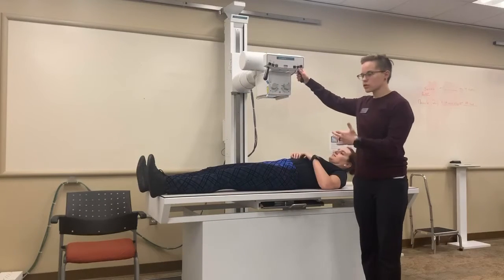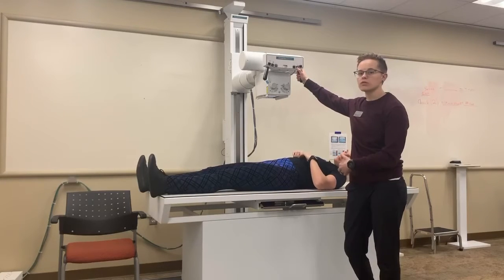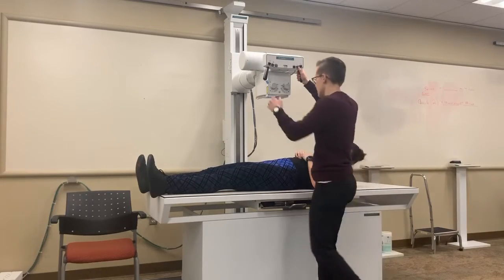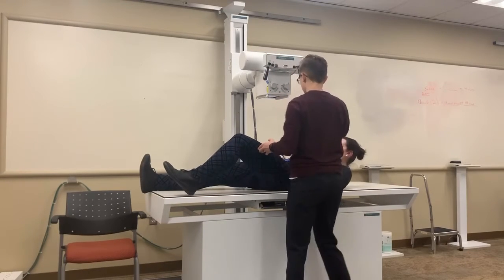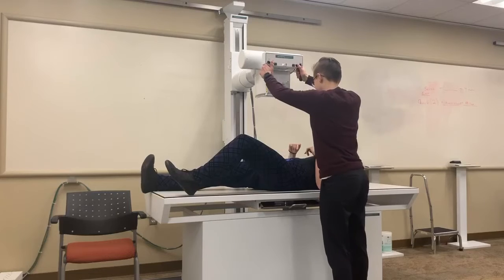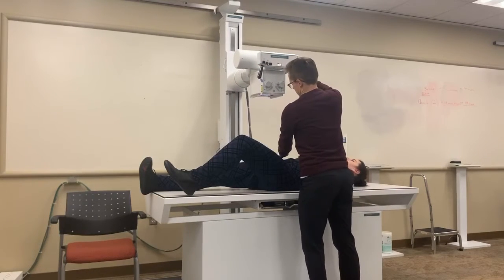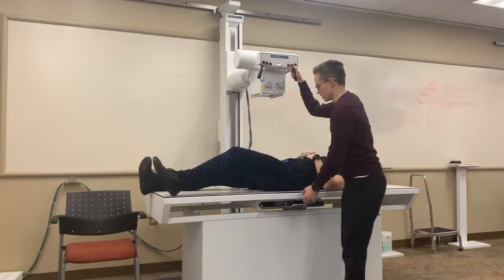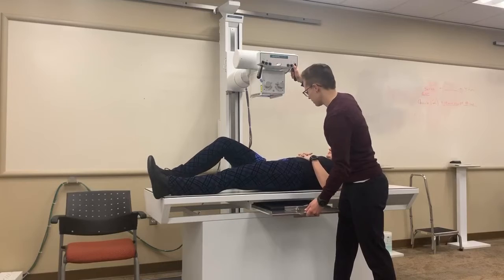So for my central ray, it goes at the hip joint. If you want to find a bony landmark, you're going to go 1 inch medial and 3 inches inferior to the ASIS. Can you scoot that way for me? Yes, perfect, thank you. So palpate for the ASIS. It's approximately 3 inches inferior and 1 inch medial. I'm going to line up my cassette.